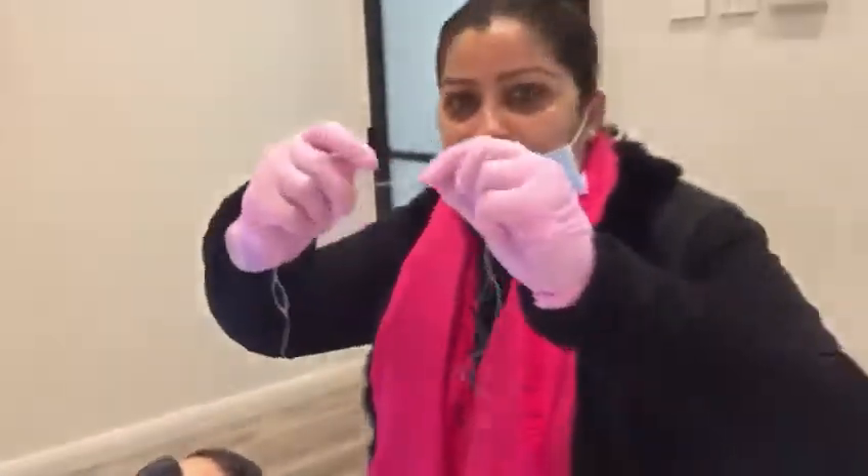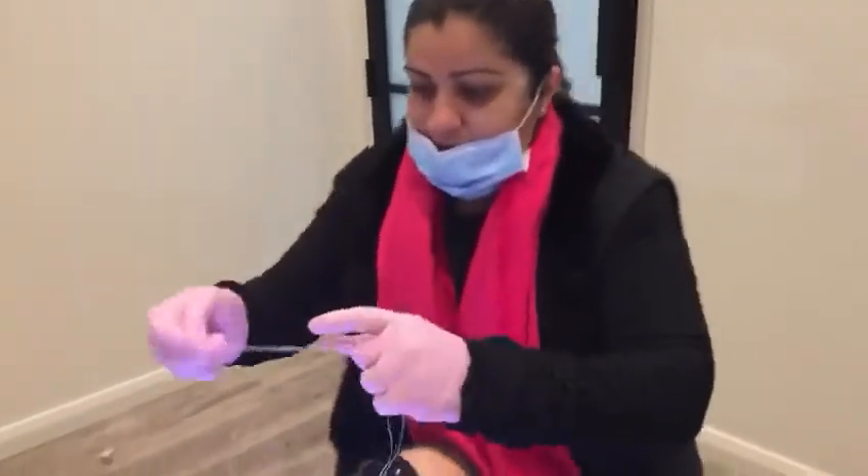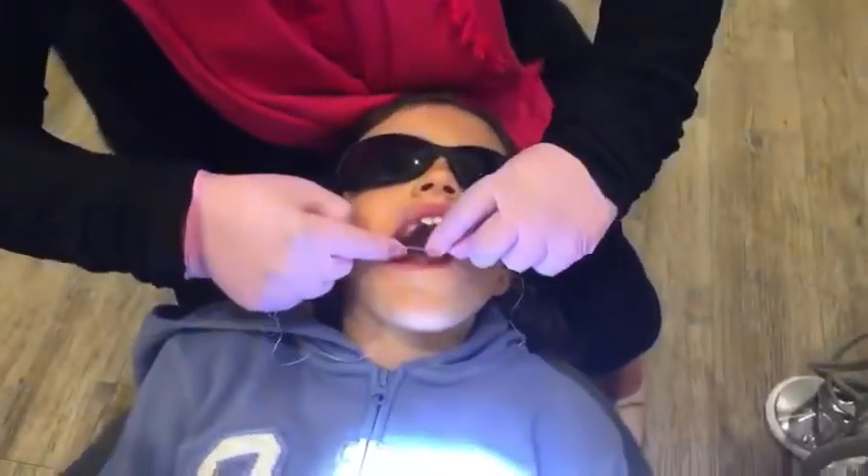So we're going to show you how we're putting it in. We've got this contact here — can you see it? Let's get the light here. We've already put one spacer on the 26 mesial, and we're going to put one here now.